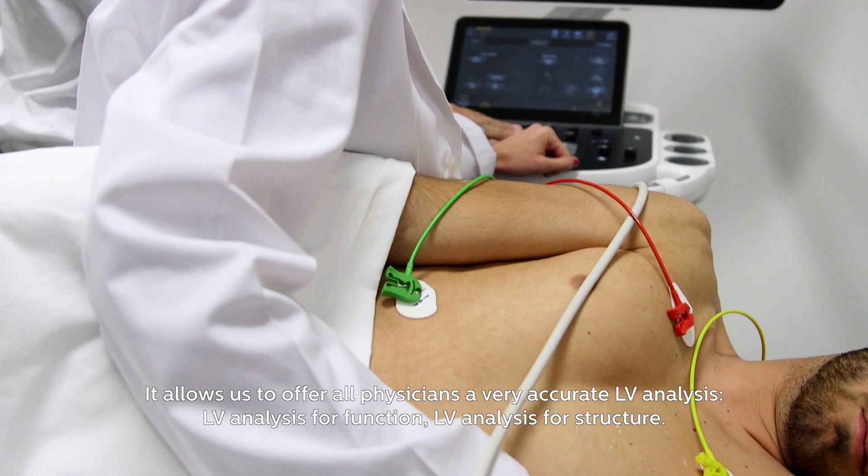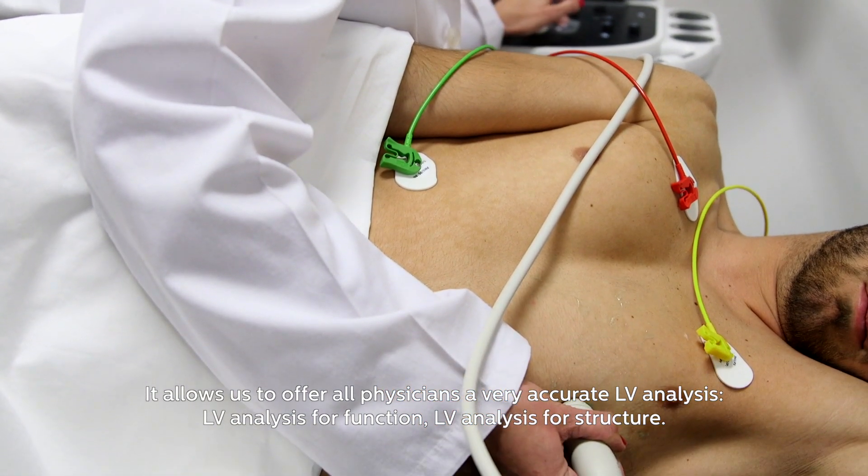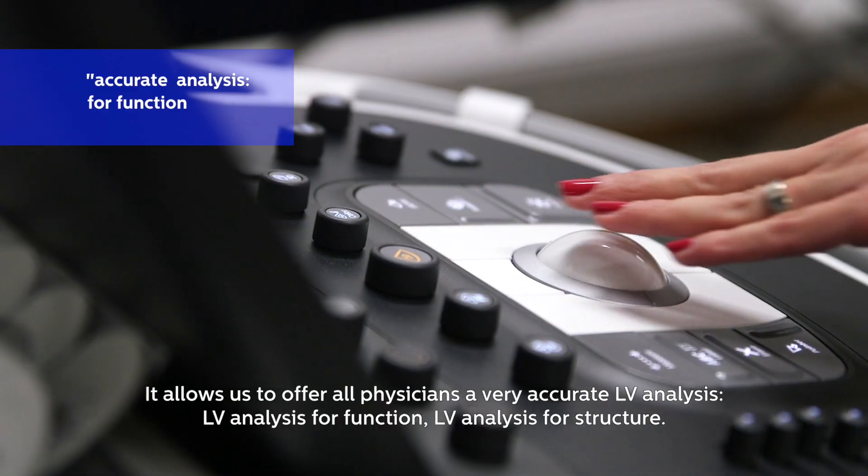It allows us to offer all physicians a very accurate LV analysis — LV analysis for function and LV analysis for structure.